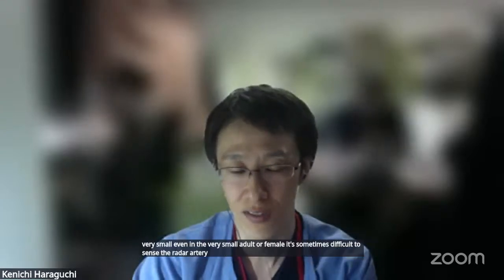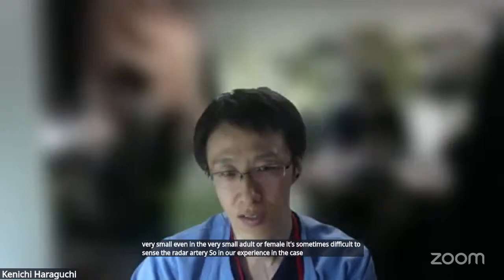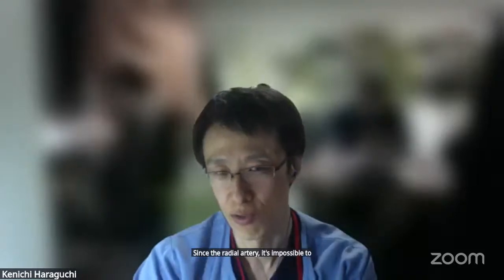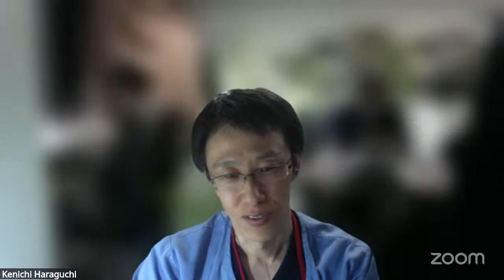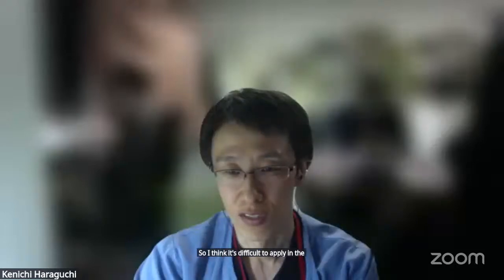In our experience, in cases where we cannot sense the radial artery, it's impossible to puncture even if we use ultrasound. So I think it's difficult to apply in pediatric patients.